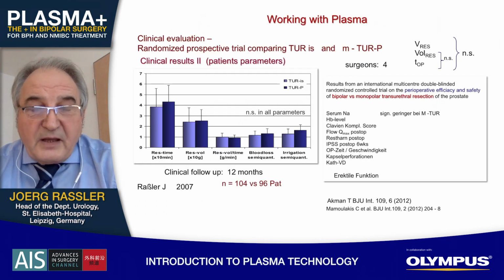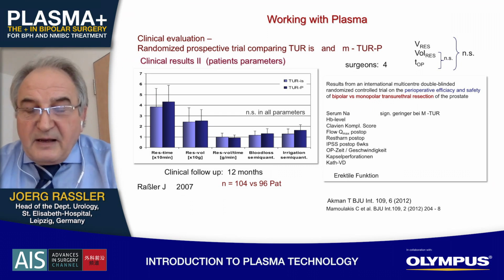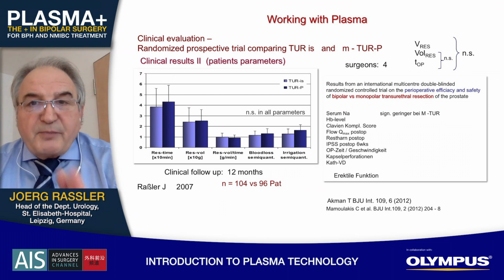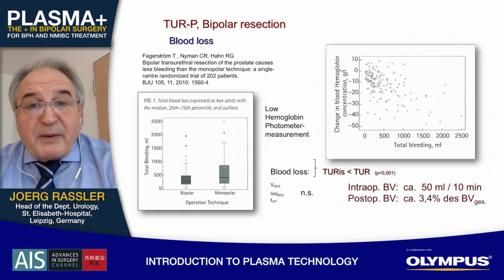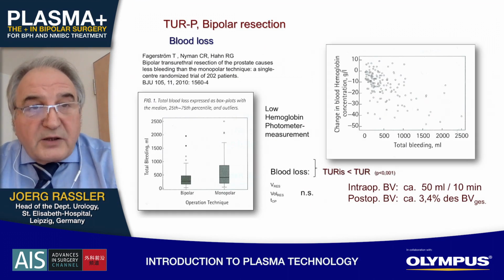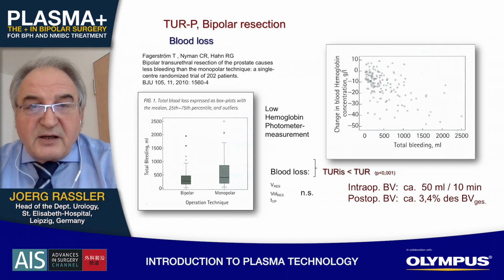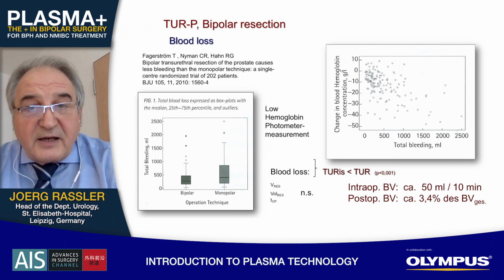We speak today about the anatomical enucleation or anatomical resection of the TUR, and that's really important to preserve important functions for the patient. When we started with the bipolar resection, we had a small study. It was limited to BPHs of only 60 grams to enucleate, and what we saw was, if we do an excellent resection with bipolar or monopolar, the results according to the micturition parameters are very, very similar. But with the bipolar one, we saw additional advantages. One of these advantages was a reduced blood loss.